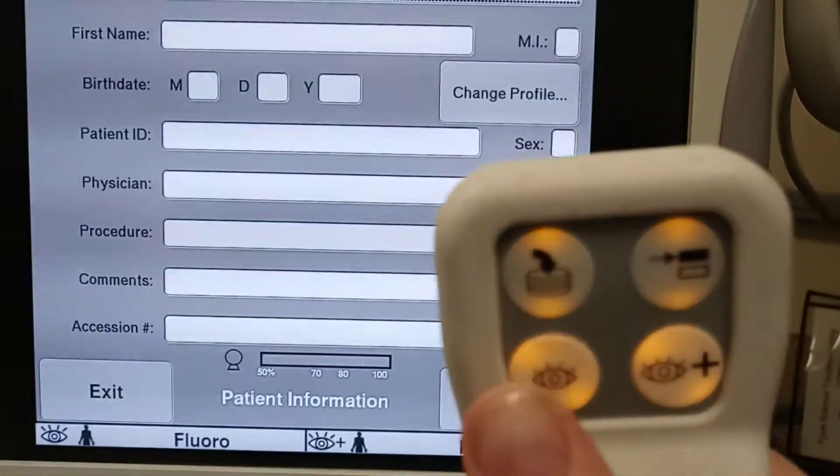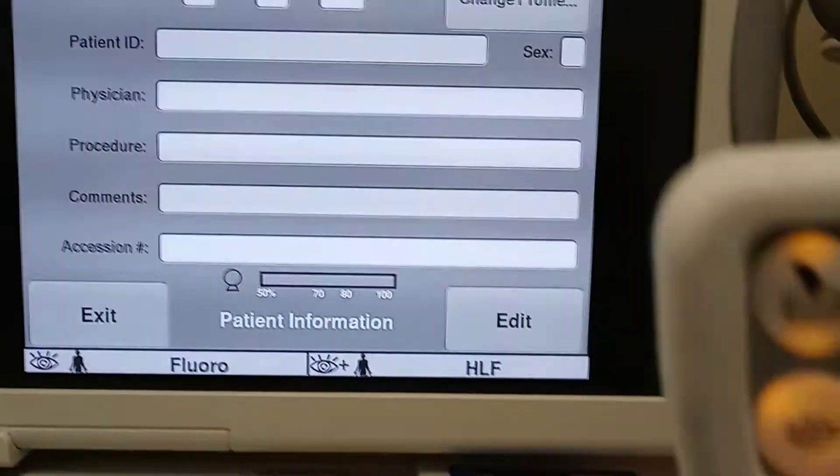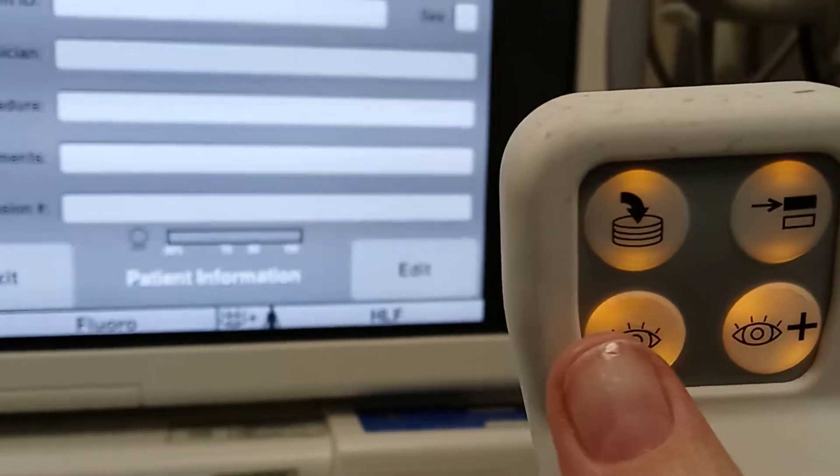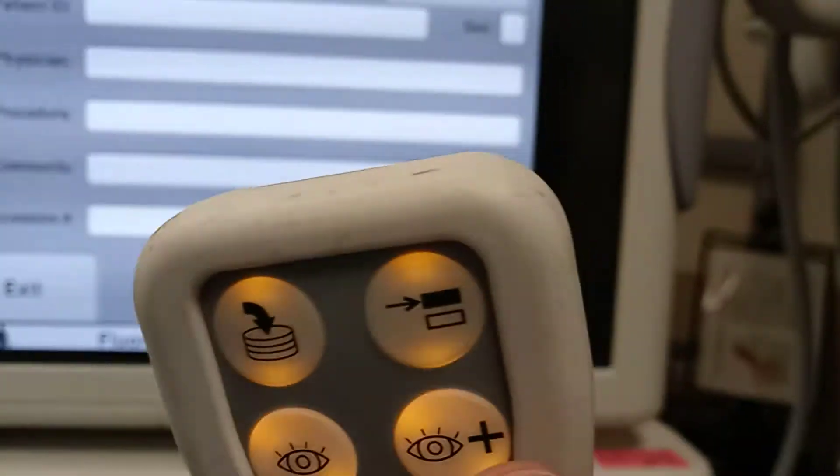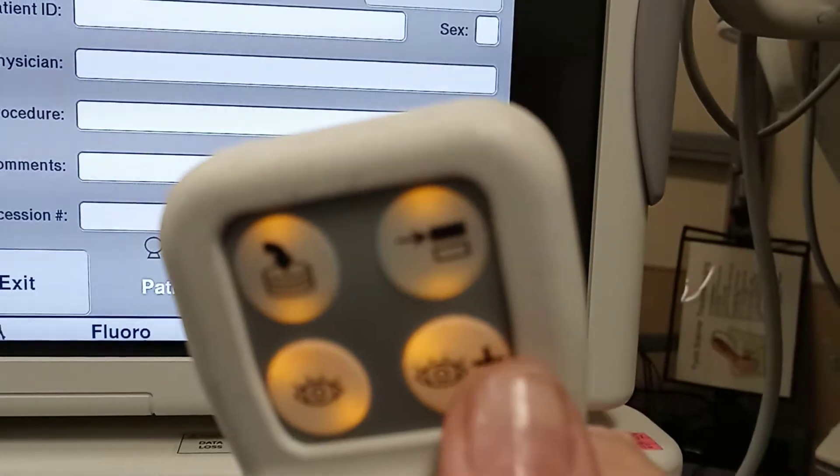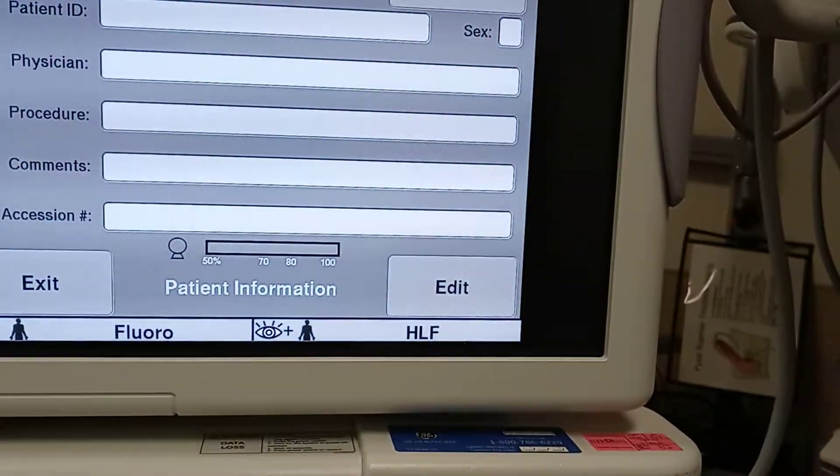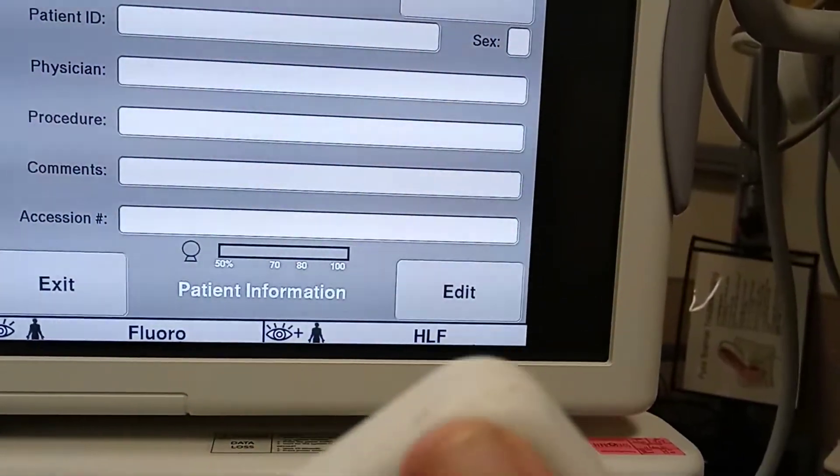You've got your remote control right here. The eyeball corresponds with fluoro right there. This one corresponds with high level fluoro.